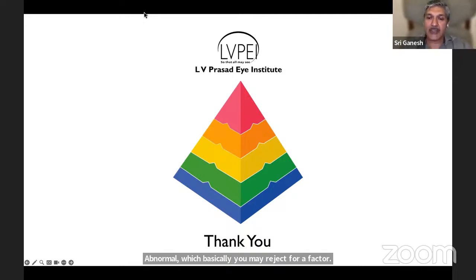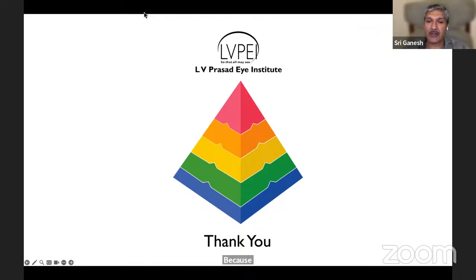We use the MS39, which I feel gives a better indication for refractive surgery and gives the epithelial maps. See, there is a misconception that keratoconus or ectasia starts on the posterior surface of the cornea, because keratoconus starts basically, the pathophysiology is fibrillation of the Bowman's membrane and then a weakening of the Bowman's membrane, and then the ectasia starts on the anterior surface.